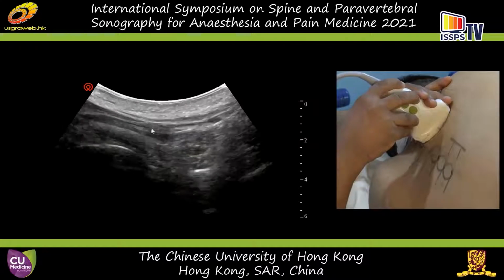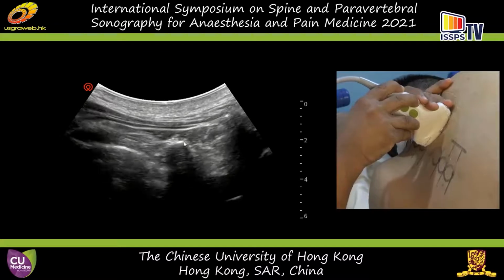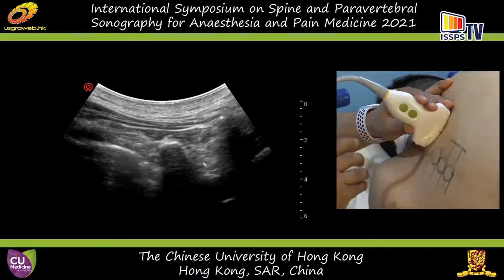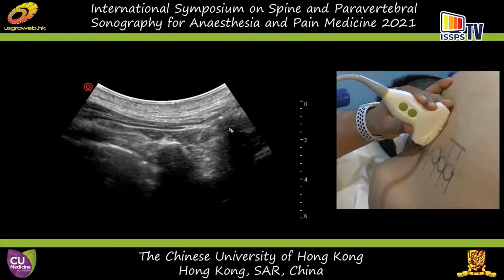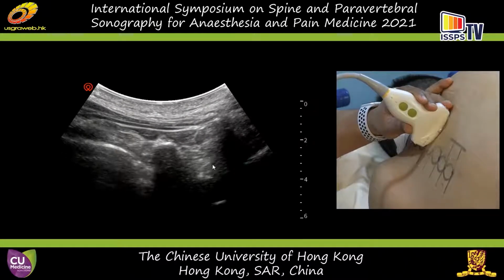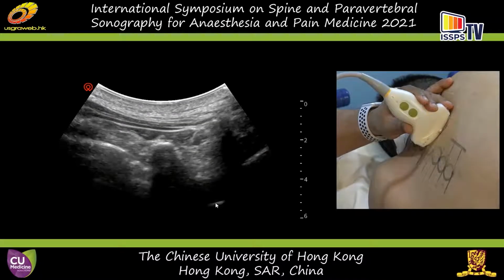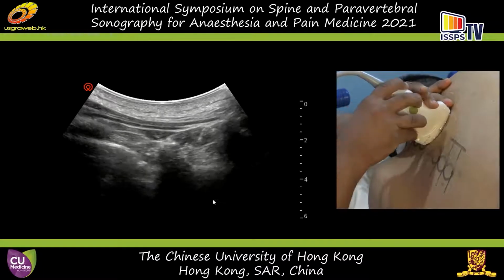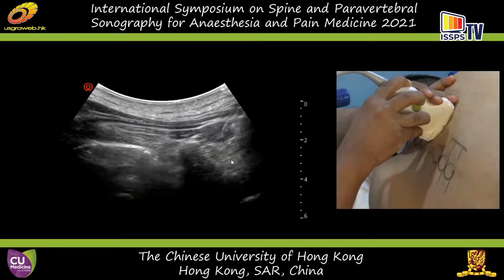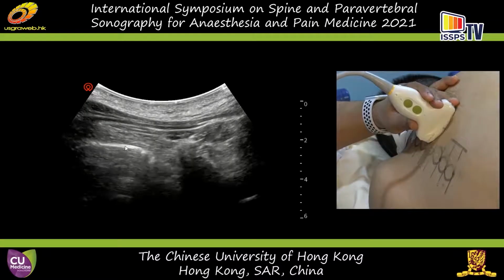If I now slide the probe slightly caudad, you'll see the rib window will disappear, and now the transverse process window, or the Dr. Shibata window, is here. You can see here the spinous process, and going inferiorly the transverse process, and the lamina in the middle, okay? You can also see through the interlaminar space, we are seeing part of the spinal canal medially. So that is indeed the spinal canal, and you can see part of the anterior complex at that vertebral level, okay? Now, looking at the paravertebral anatomy, you can see the pleura is lateral, which is the hyperechogenic structure sliding with the respiration.